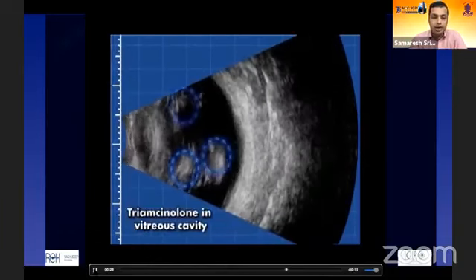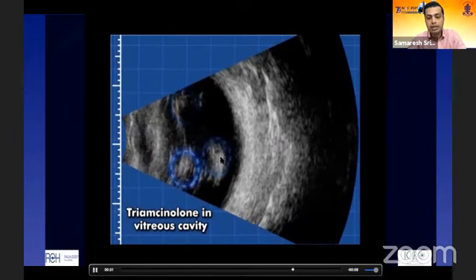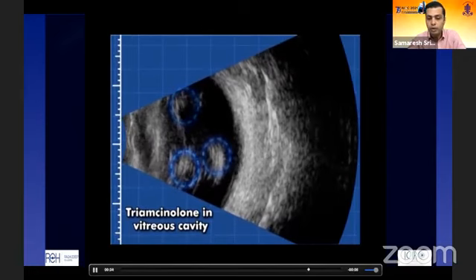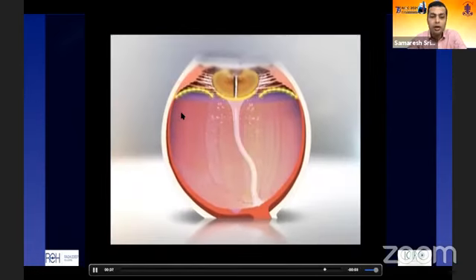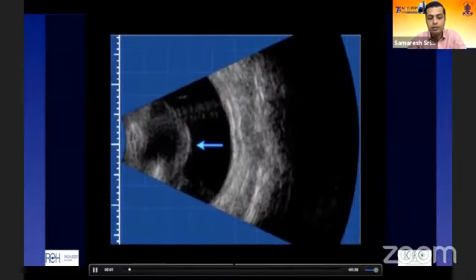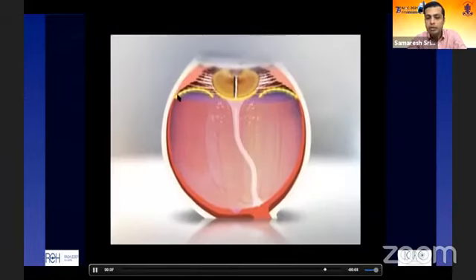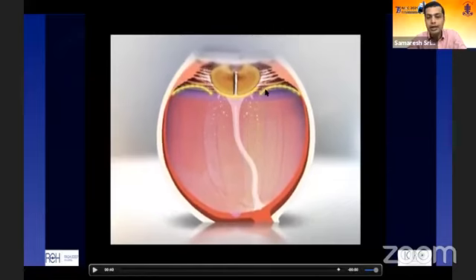And notice that at some point, the entire anterior vitreous face ruptured. So anteriorly, if you look through a microscope, the posterior capsule was intact, but the anterior vitreous face ruptured and the entire vitreous was stained by these triamcinolone particles because of the pocket being broken down. And this led us to understand that a lot of times when we see inflammation in eyes post-operatively, in eyes which have diabetes, which have vein occlusions, and we find macular edema is progressing, it's probably because, despite the anterior and posterior capsule being intact, the broken-down anterior vitreous face causes all that inflammation and prostaglandins to migrate posteriorly and eventually causes this breakdown of anterior and posterior compartmentalization.